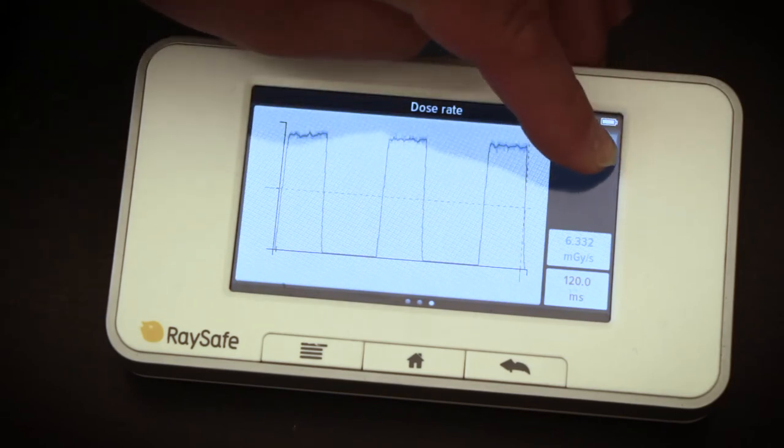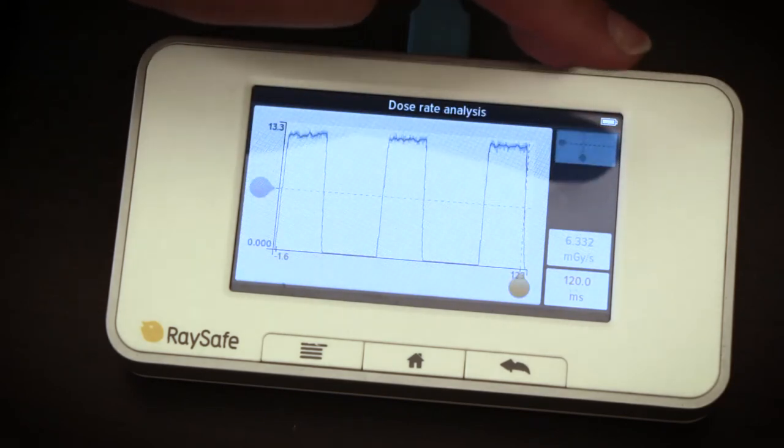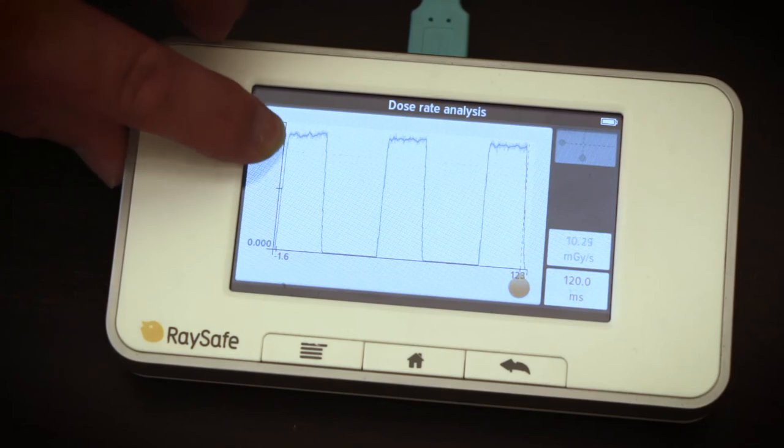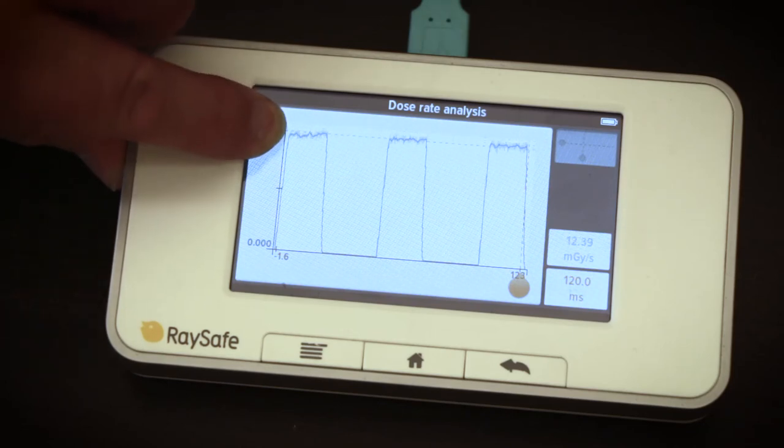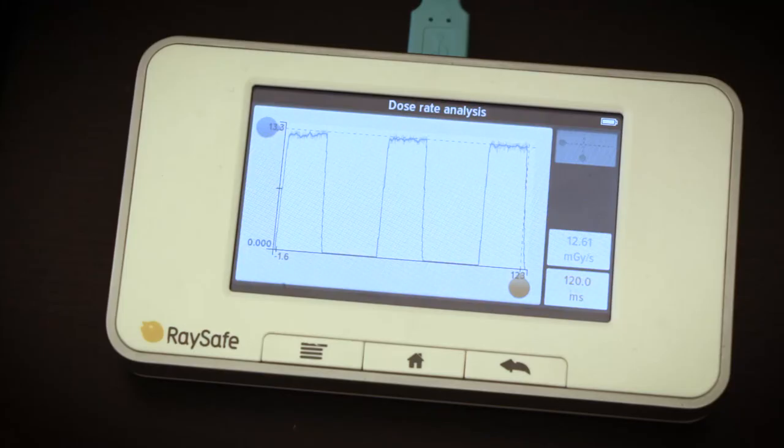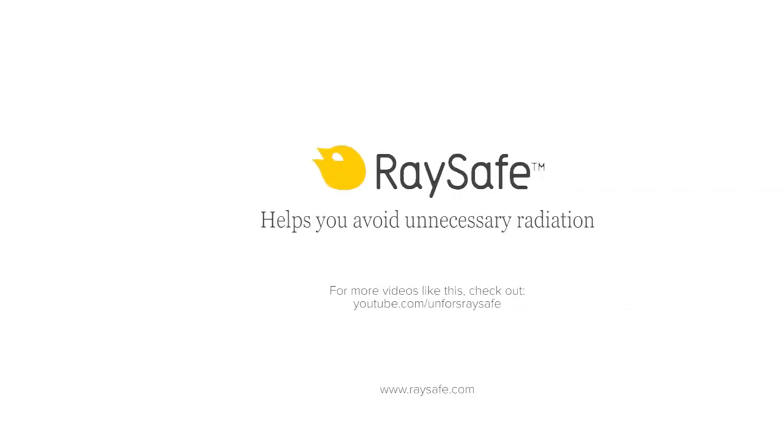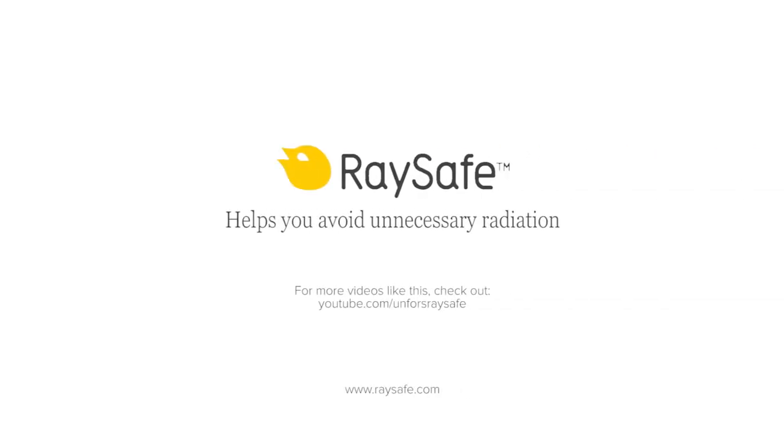press the Analyze button and move the cursor to the position of interest.